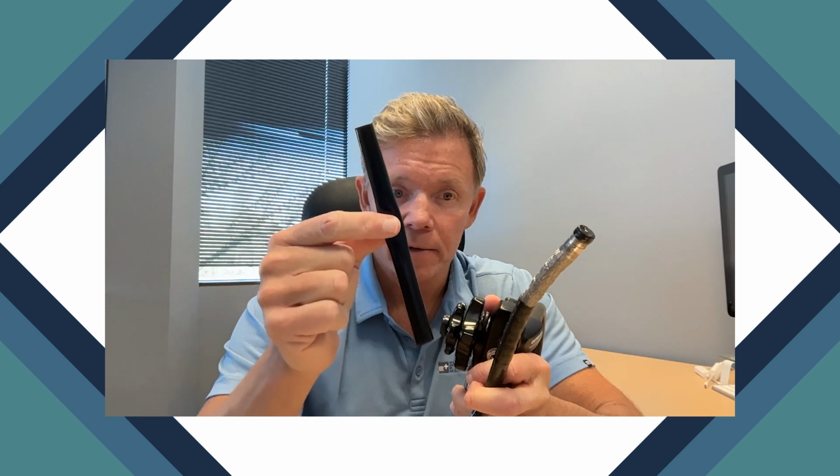Okay. And one of the reasons, Frank, tell them why the angulation and where it comes from, because of passing the sharp instrument when the scope was fully angulated. Yeah. So well, there's many reasons why you can get a leak in this outer sheath. It could be a sharp fingernail. It could be the scope was put in the sink with some other sharp instruments. It could be this tip dragged across the countertop or hit the floor. A lot of different ways that you can get a leak in this outer sheath.